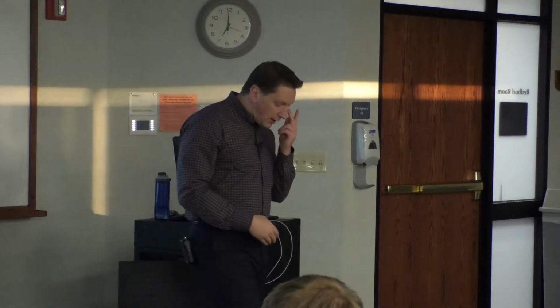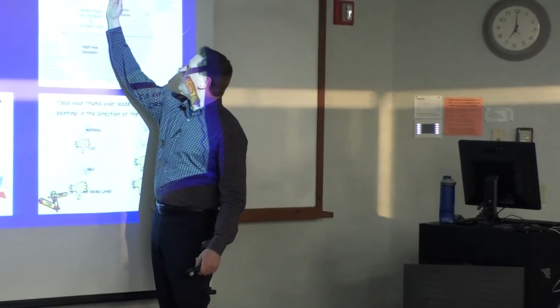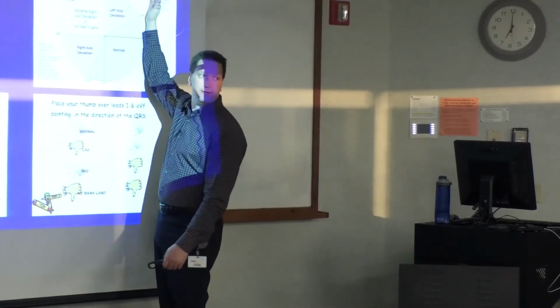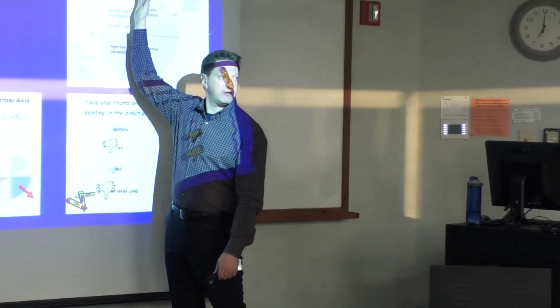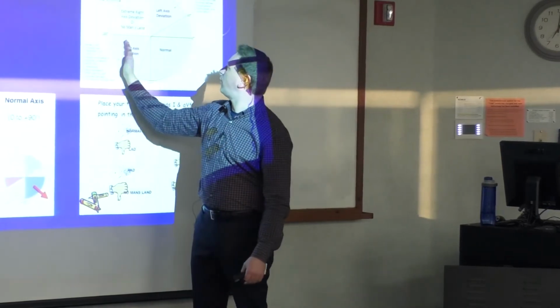So, if you have a positive lead 1, you must be on the left-hand side of the circle, okay? If you have a negative lead 1, you're going in the opposite direction and you are over here.